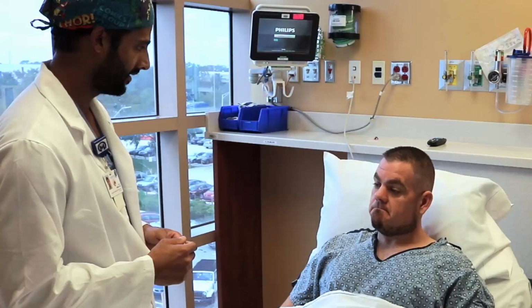The only other complication is a risk of infection. Anytime you put a foreign body into the body, there's a risk of infection. That risk is also less than 1 in 10,000, but you should know that even if you get an infection in your toe, that infection could go to the port because it's a foreign body, and that could result in us taking out the port. If we do have to take out the port, it's no big deal. That's how we treat the infection. We take these ports out when you're done with them anyway, and we can always put in a new one if we need to. Any questions?